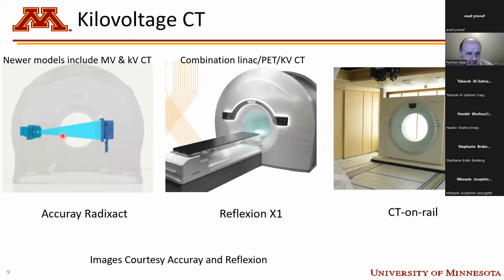IGRT RadixAct added a kilovoltage tube to the new ones, and this kilovoltage tube enables the image guidance to be done with megavoltage or kilovoltage, which is actually a major improvement to the older TomoTherapy units, where we can only use the megavoltage CT on them.